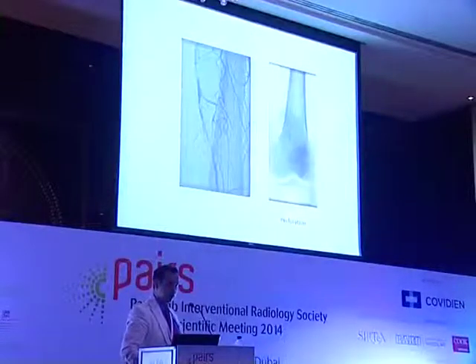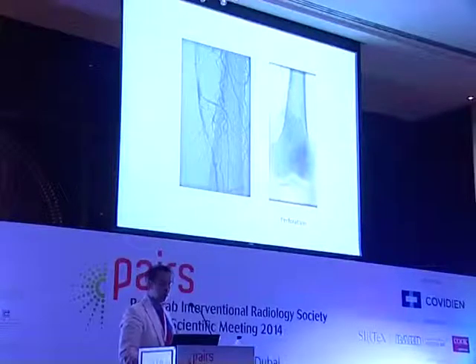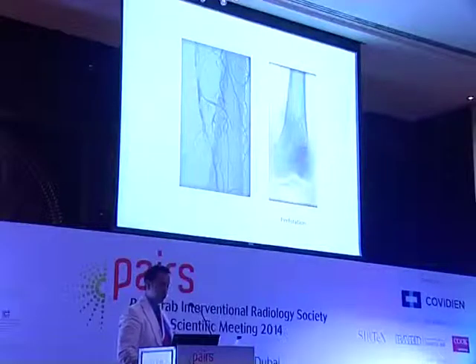We start with subintimal recanalization through the Hunter channel, and after crossing this area and making an angio, we have extravasation with a leakage here in the soft tissue, meaning perforation.